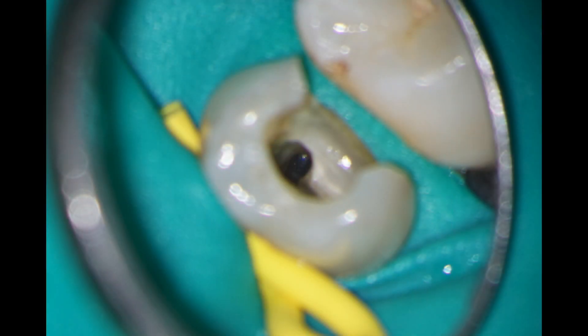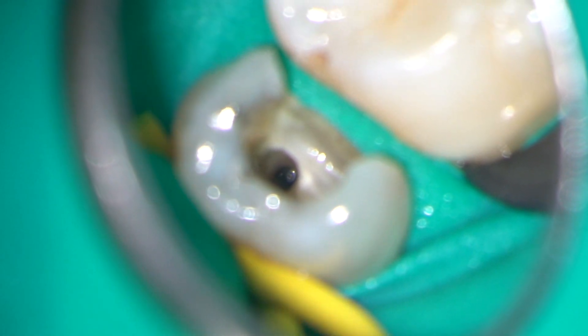I used the Wave 1 Gold instrument to prepare down to the level of the fractured instrument, and here you can see that piece of instrument sitting at the apex of the distobuccal canal.